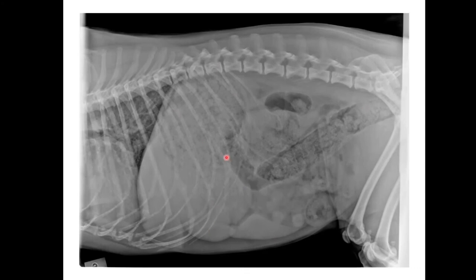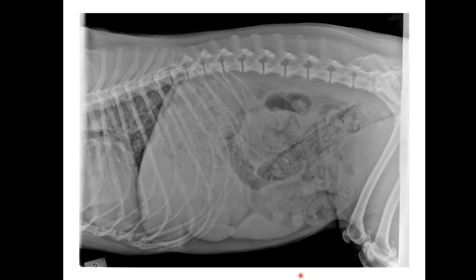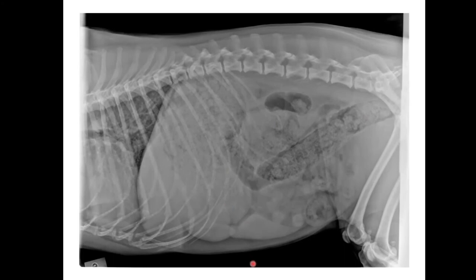The intestine is dilated — there are some dilated intestinal loops — and I have possibly some loss of serosal detail, especially localized centrally and cranially. I can see the spleen. I see a lot of intestinal loops with all this material. My differential would be partial obstruction and obviously with consequent ileus. I would like to do an ultrasound.